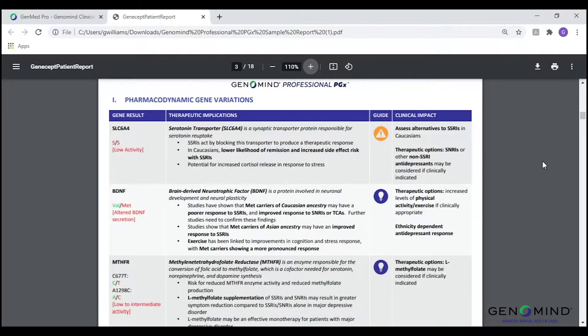Starting on page three of the patient report, you will find our gene variations pages. The first part of these gene variations pages will highlight our pharmacodynamic genes. Our report highlights 15 pharmacodynamic genes that encode for proteins that influence sensitivity to medications. You will find the specific gene as well as the patient-specific genotype on the left side of the page. Additionally, the information presented in brackets underneath the genotype highlights the associated activity, response, sensitivity, or risk for that particular genotype. This is also known as the phenotype.